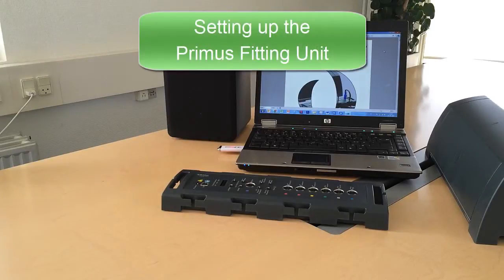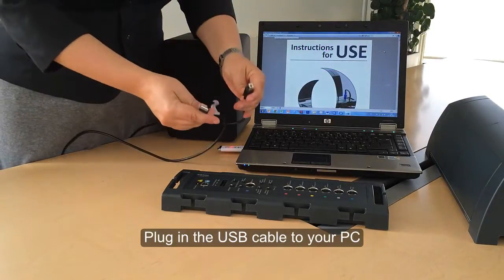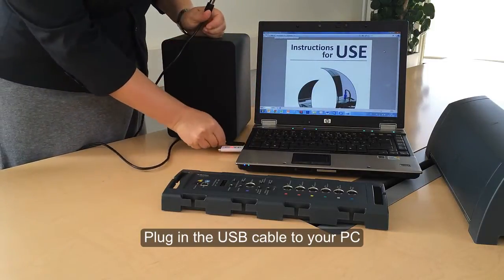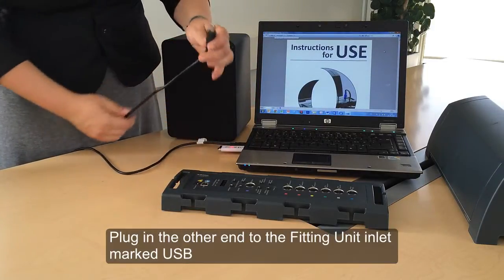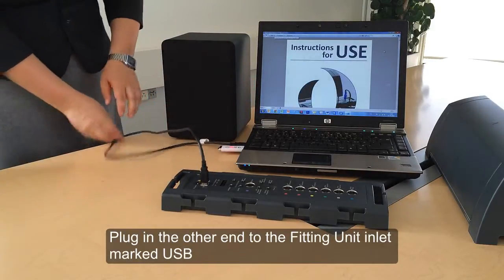Let's have a look at setting up the Primus fitting unit. First, connect the USB lead to an empty slot on the operator PC. Then connect the USB cable to the inlet marked USB on the fitting unit.